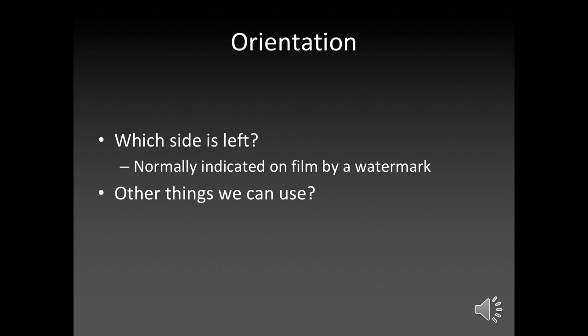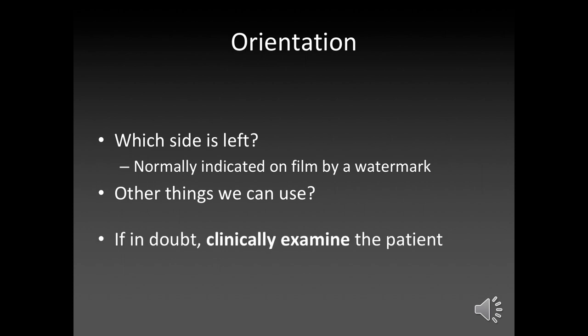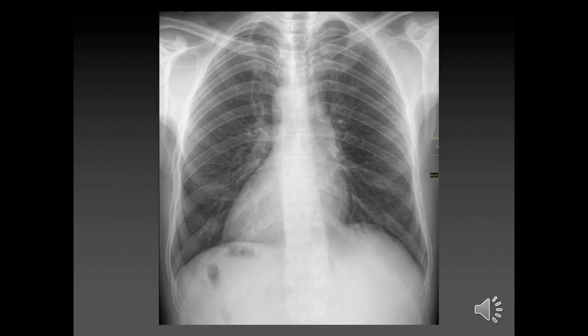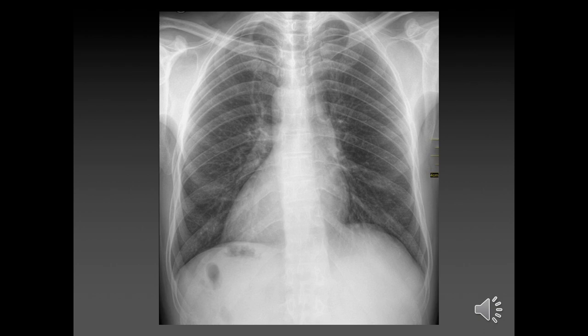So the three things you can use are the heart, the liver, and the gastric bubble. In a normal patient, you'd expect the liver to be on the right and the gastric bubble on the left — that's because the stomach is on the left and you see a bubble in it. The liver is on the right and, as you probably remember from anatomy, it pushes the diaphragm up and the kidney down, giving you the right hemidiaphragm being slightly higher. The heart is obviously pointing to the left.